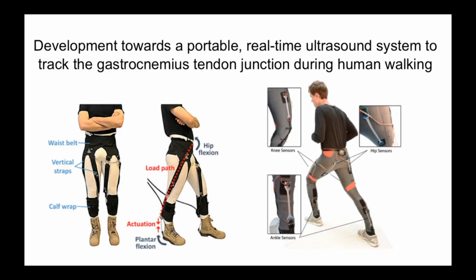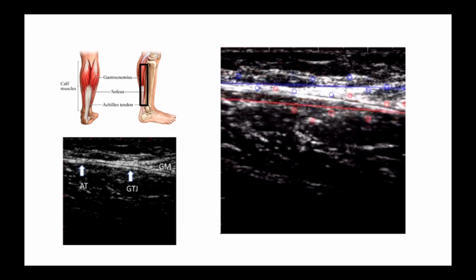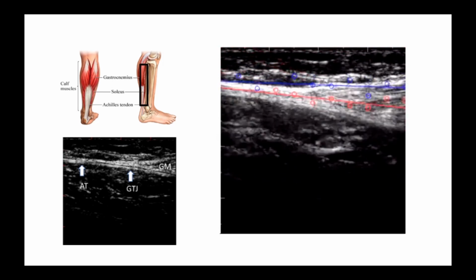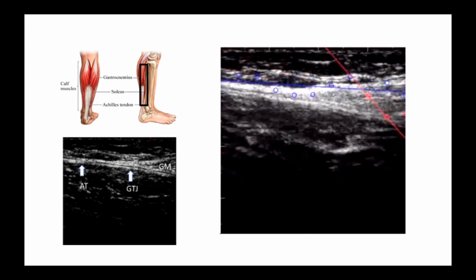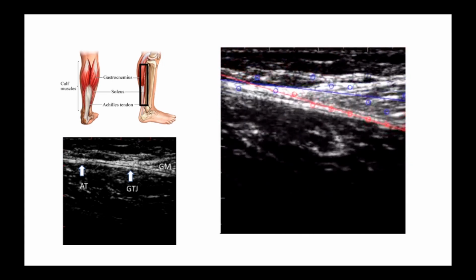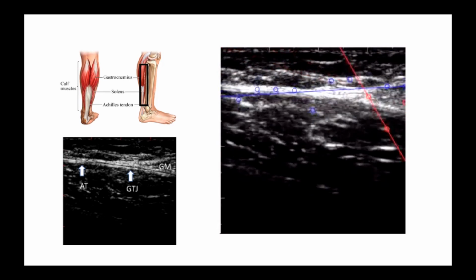Soft robotic exosuits provide increased mobility to healthy and physically impaired individuals through gait assistance. To provide effective, individualized biomechanical assistance, the exosuit must work in parallel with the specific movement of each user. Therefore, a real-time ultrasound system is being developed to identify and track muscle and tendon features to determine force and timing of actuation by identifying gastrocnemius concentric contractions in the push-off phase of gait.